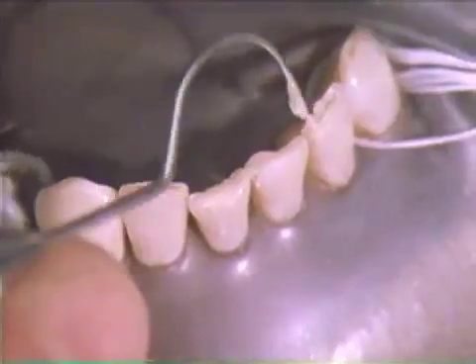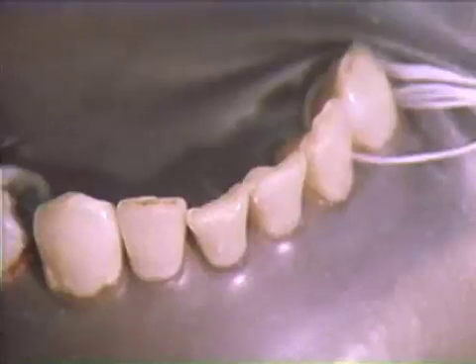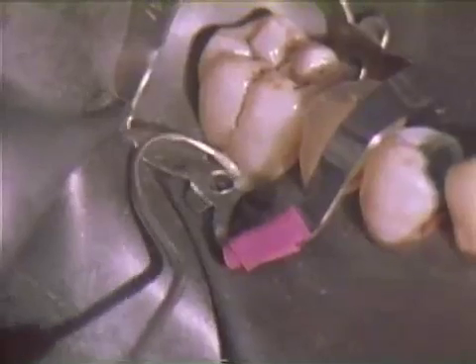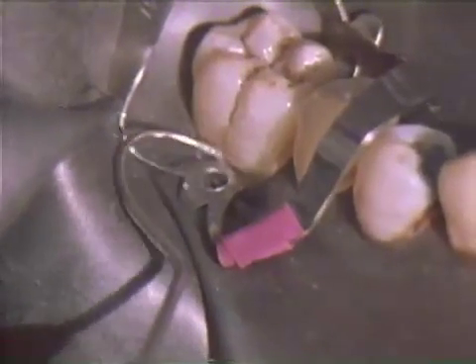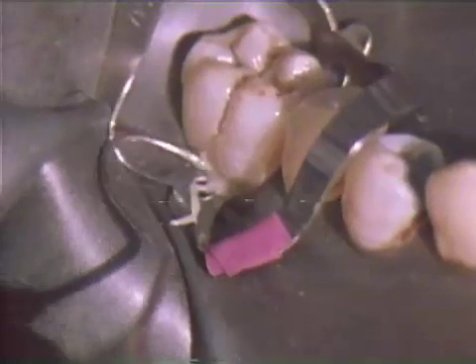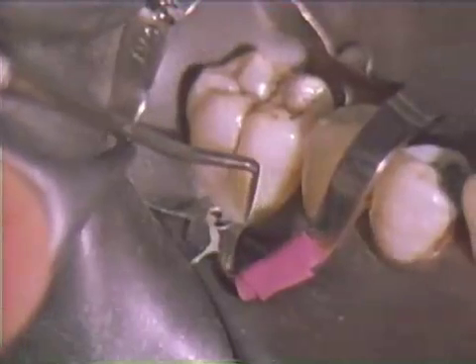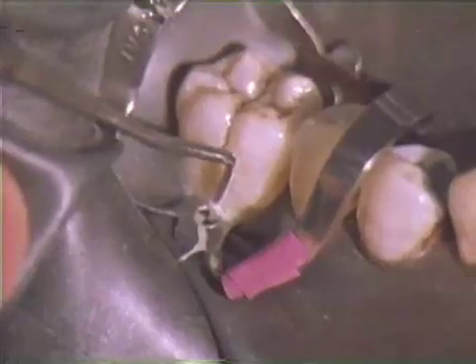When adequate areas of enamel exist around a lesion, an acid-etched retained restorative resin may offer better treatment. Correctly mixed glass ionomer is placed into the preparations with the tip of an explorer. The material is added in small increments to minimize the possibility of air entrapment and resultant voids. Once approximate contour is achieved, the material is allowed to harden.